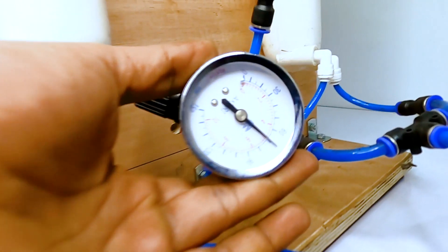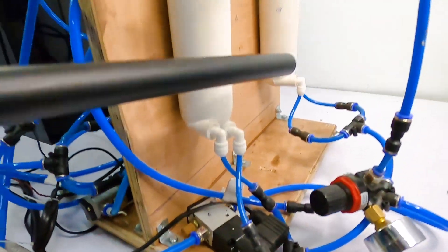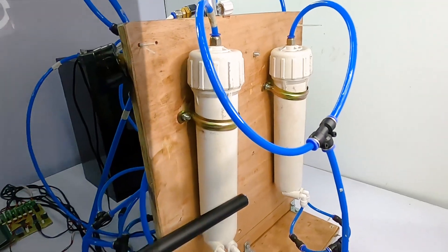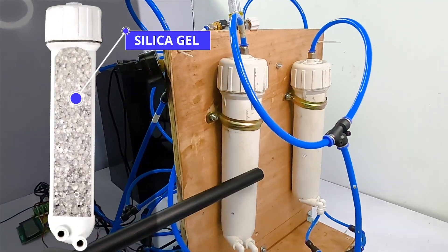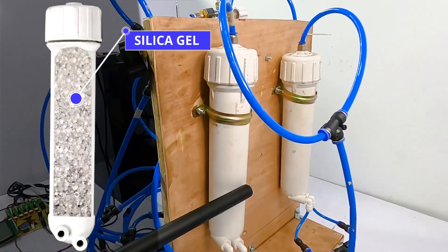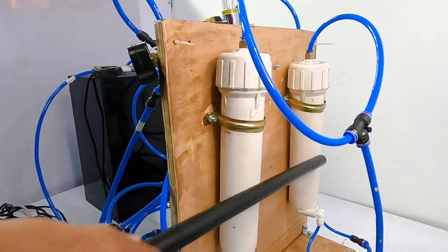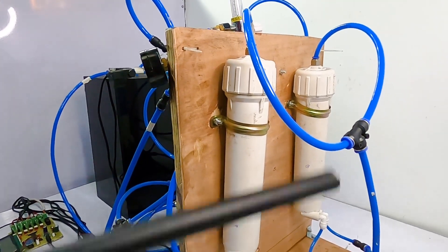So this air is supplied to the silica gel cylinders. These two cylinders, as you can see here, are used to filter out moisture content from the input air so that we get moisture-free air which can be supplied to the other cylinders.